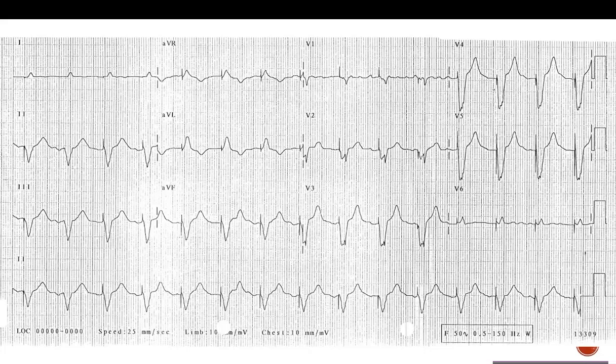So it's going to sense and pace the ventricle. Pacing is to deliver an electrical impulse that generates an action potential. There is an electrical impulse and there is the QRS, so we know about the capture. Sensing means that if there is any electrical signal within the ventricle, the device is going to see it. Now we're not sure if the device saw anything, because everything here is paced, there is no intrinsic rhythm. So I can't say anything about the sensing, right?